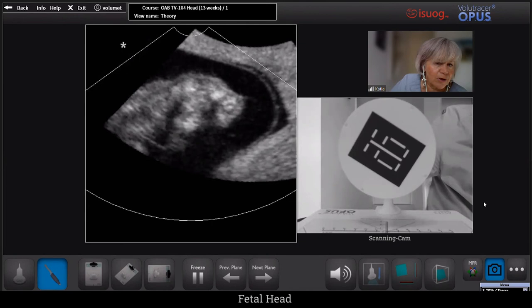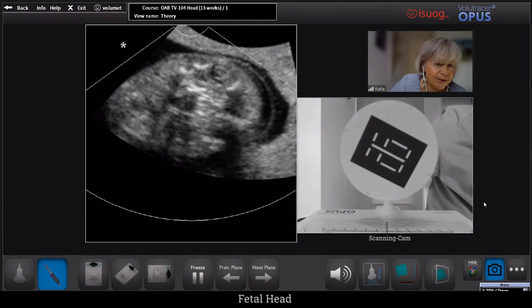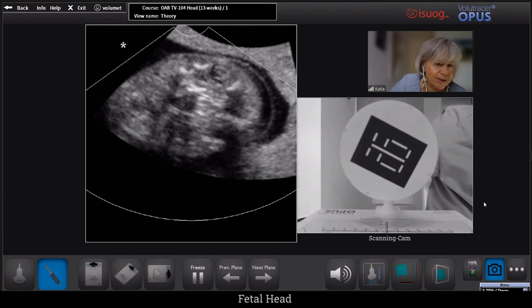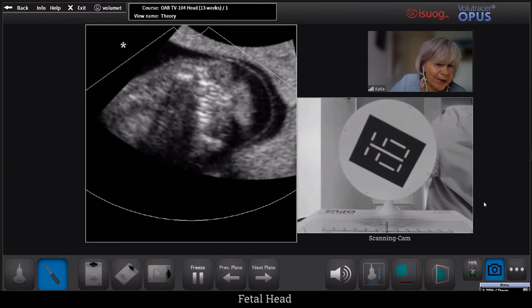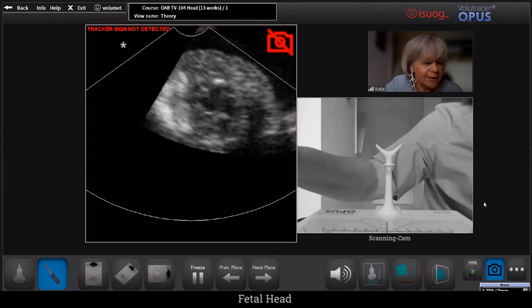So this was again a very nice way of looking at the intracranial anatomy. Here we can also see the lenses in the eye, and we can even see the retronasal triangle appearing. We will now move to another volume.